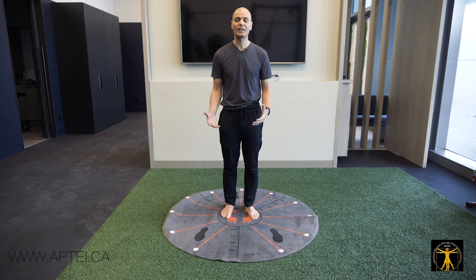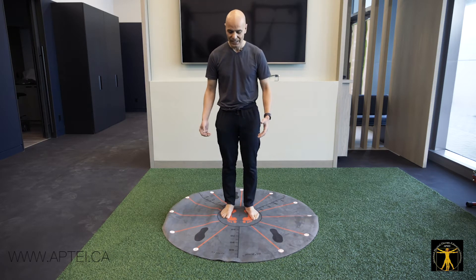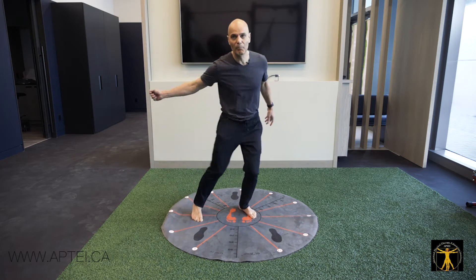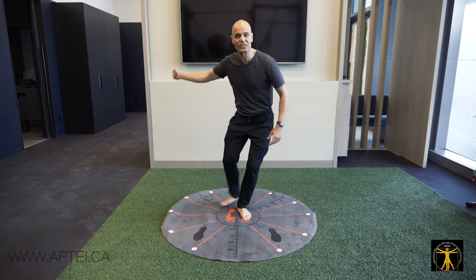If they have to participate in a sport like tennis, you don't just do lunges in a perfect line. You play tennis by going in multiple directions, and this is the best way to simulate it.